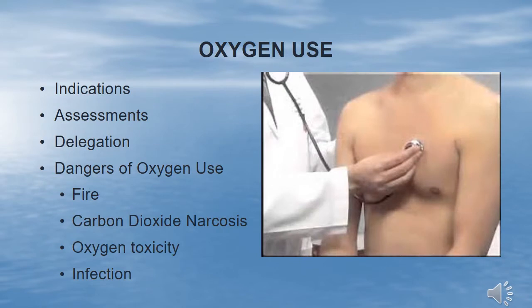Patients with impaired gas exchange often require supplemental oxygen. This may be a short-term therapy, like during surgery and recovery, or may be used continually for those with chronic respiratory conditions such as chronic obstructive pulmonary disease, or COPD. Oxygen therapy is beneficial but can have dangerous effects if given inappropriately or in an unsafe manner. You will study in greater depth about the purpose and indications for its use in your gas exchange lectures.